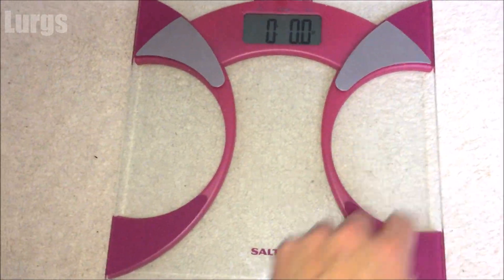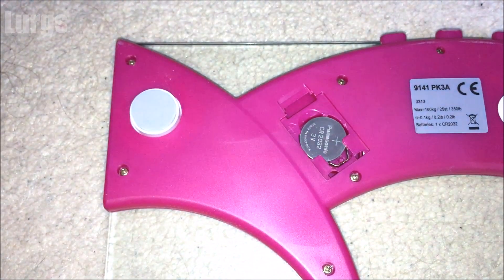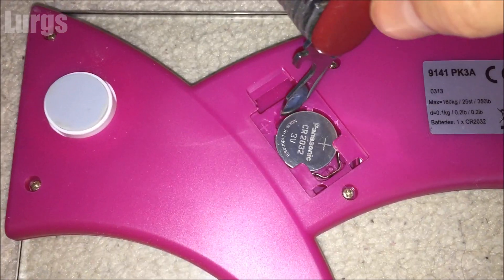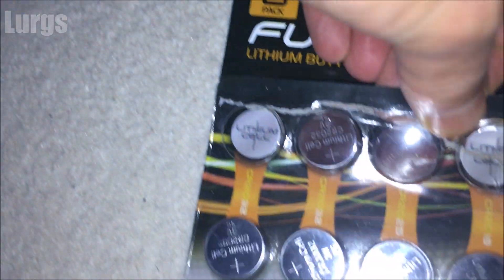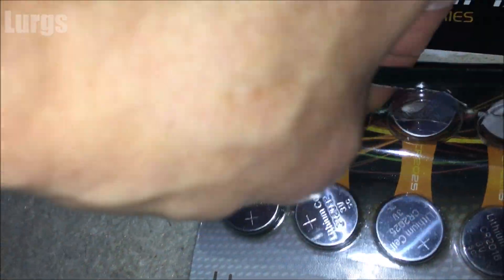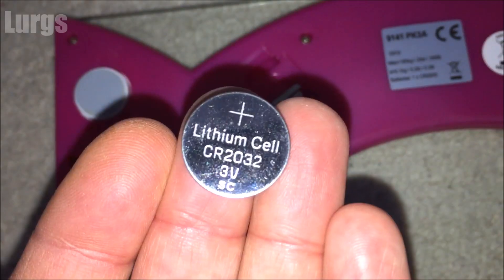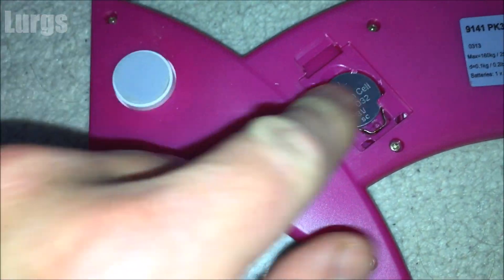Flip it over like a pancake and you've got a little compartment here. Just open that up and get a small blunt instrument — I've just got a small pen knife — and flick it against the spring there. It just pops out. Then get a CR2032 battery; I got a whole pack of these from Poundland. Just push it in and push down.